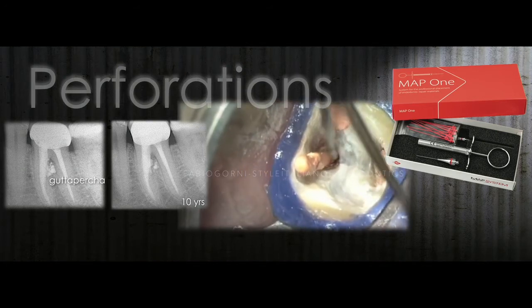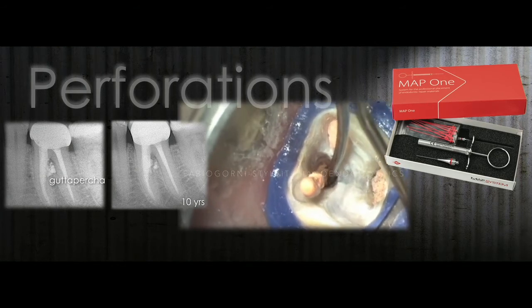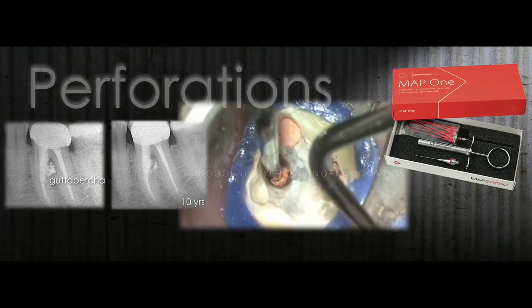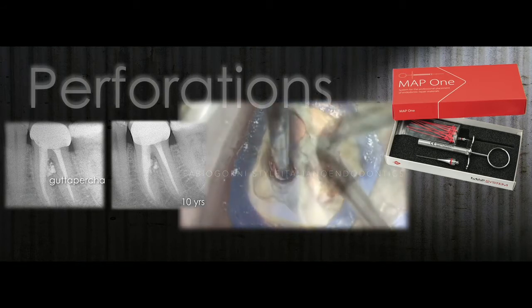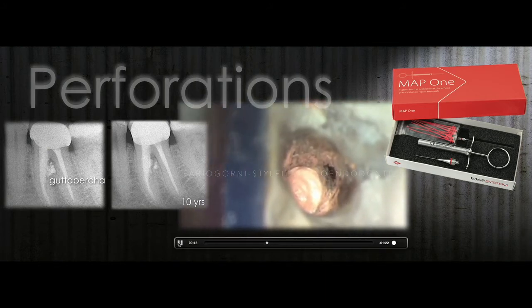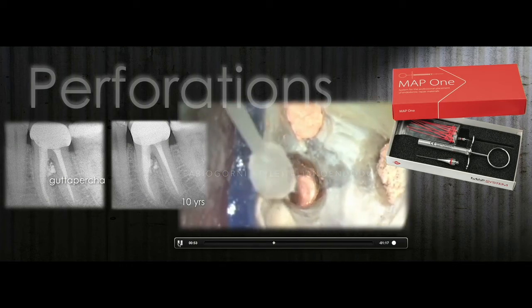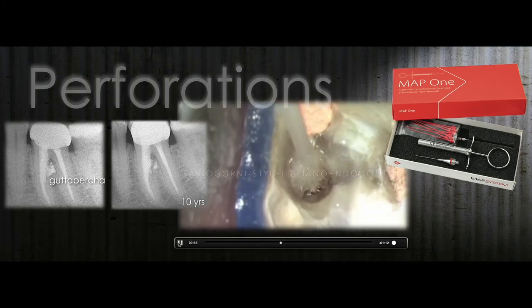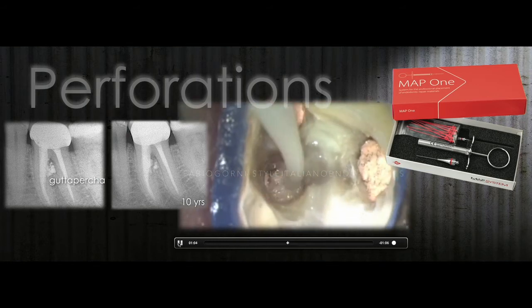To follow the technique in the correct way, we need to control perfectly the exudation from the perforation, but through the microscope we can do it. So that's why we can pack the apical 1/3 of the root without any problem. After the packing, we can clean exactly the other part of the canal, and we can use a microbrush with sodium hypochlorite or with alcohol just to prepare the area for the MTA.